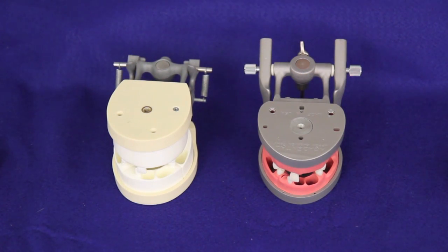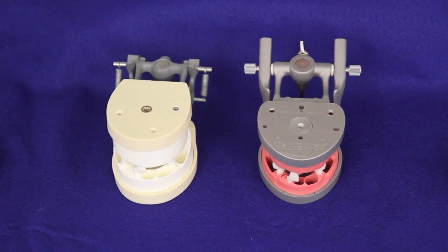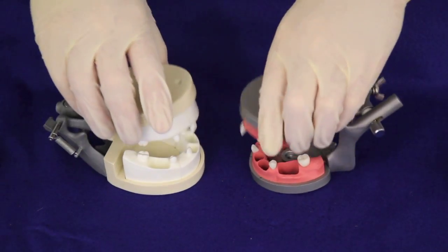These typodonts are purpose-made for the REB licensing exam. They can also be used for simulation exercises. Although they look quite different, they function in very much the same manner and are largely equivalent.